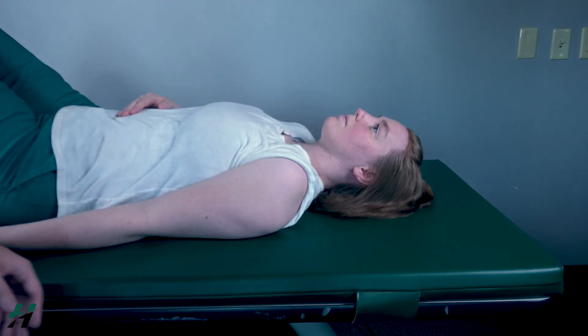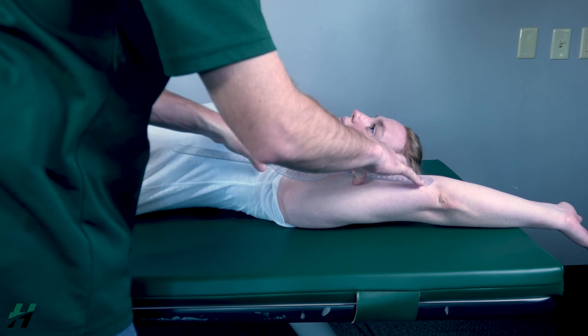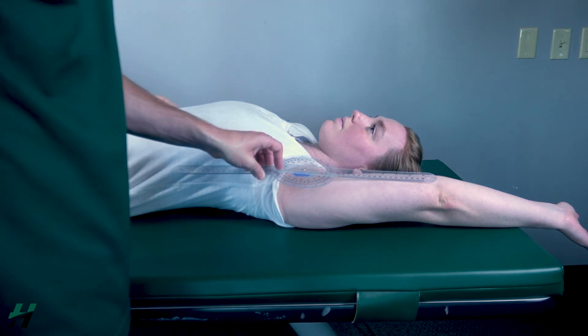Rachel, if you could perform full abduction for me. So have the axis on the humeral head, running alongside the shaft of the humerus. And we are looking at 175 degrees of abduction.